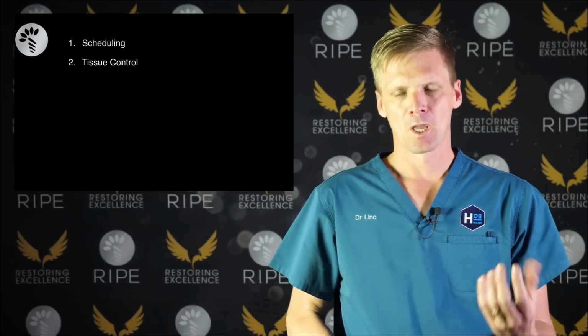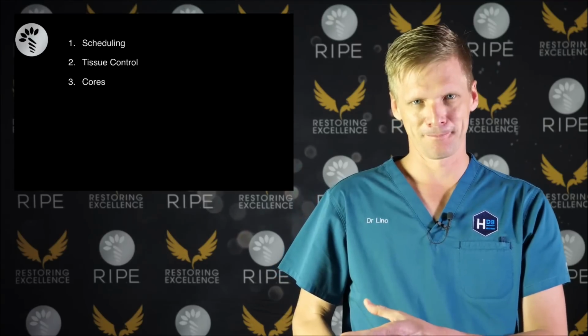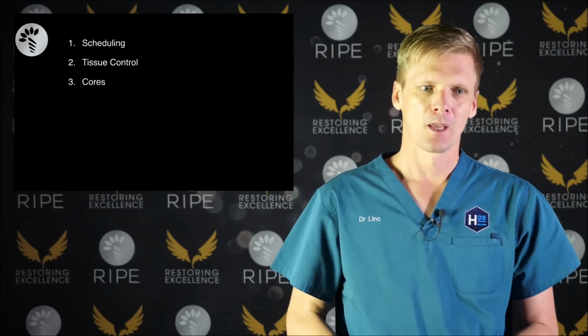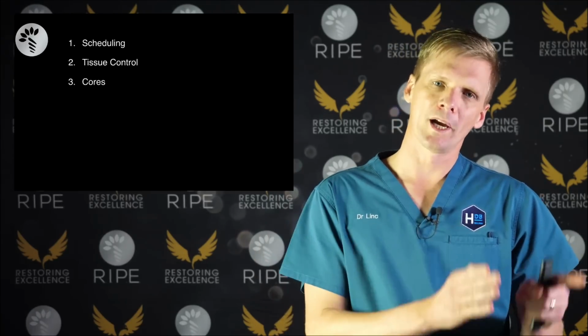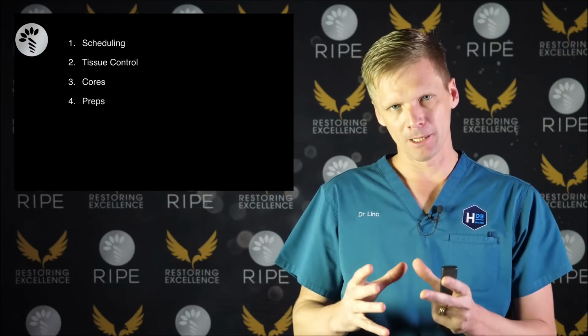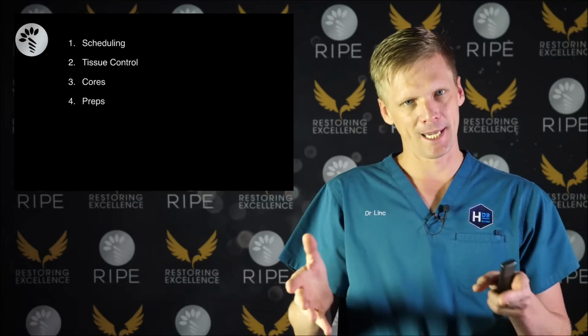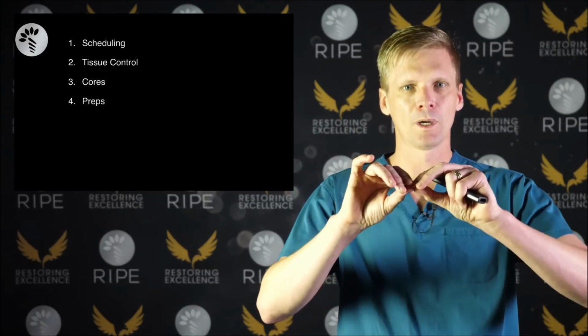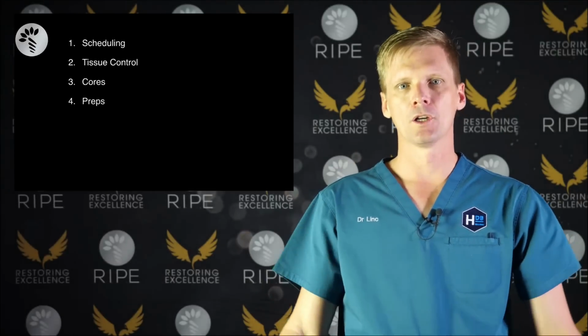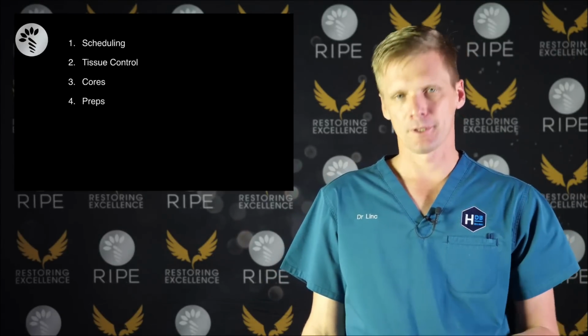Cores. The core is one of the most important parts of your impression. And I'm going to tell you about that in a moment. And so is the prep. So the way you prep and the way you do your core is incredibly important to how well either an optical scanner can scan or how well silicone can run over the prep. And so if you prep in a certain way, it's almost impossible to get a good impression.